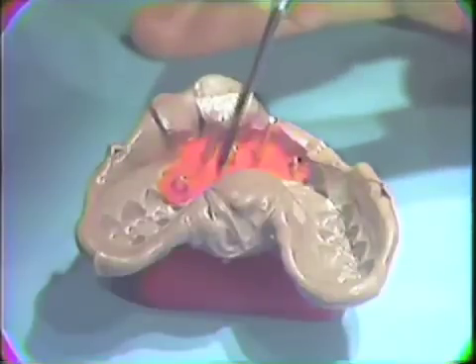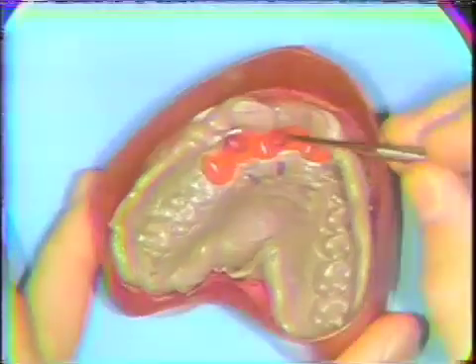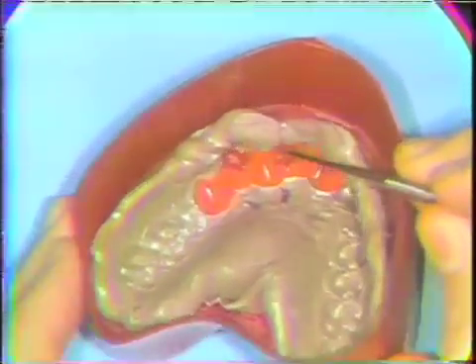Anti-rotation grooves or notches can be placed adjacent to the dowel. The impression has been boxed, and you will note small balls of utility wax at the end of the dowel pins, as well as the anti-rotation notches.